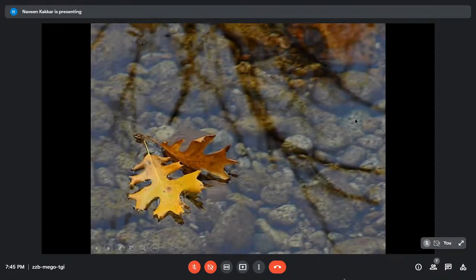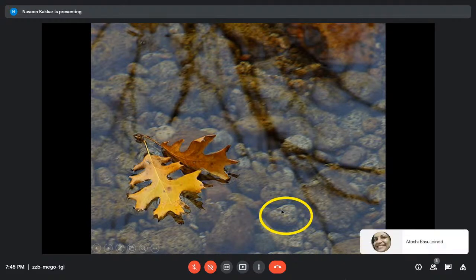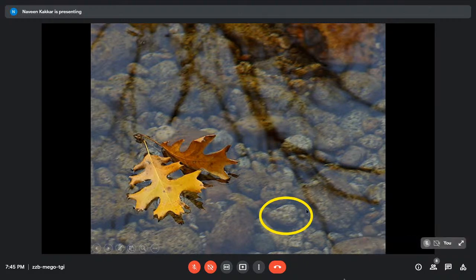So I use this example which I had last year. Just imagine this is a rivulet. We obviously see leaves. And let's say I talk about this pebble. Imagine if I had leaves in my hand along with the pebble and I threw them into this rivulet. Just by the weight, the pebble will settle down, and if the water is moving fast enough, it will tumble down a bit. But the leaves, being very light, will go fast. Now imagine this is your lighter hemoglobin, where the charge is less. Here is your more charged hemoglobin that the buffer cannot elute out. That stays in the column for a long time. This comes out from the column in a faster time.